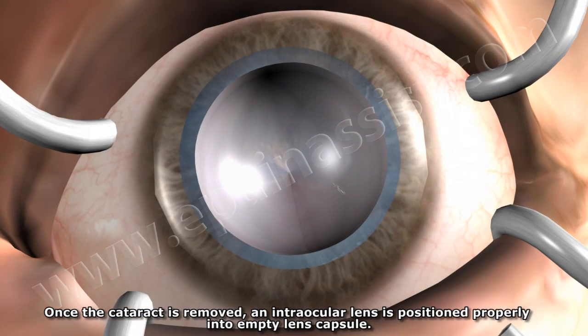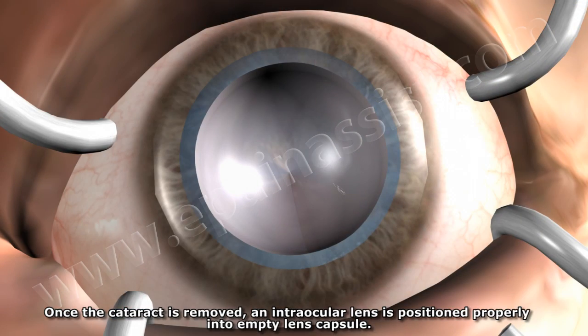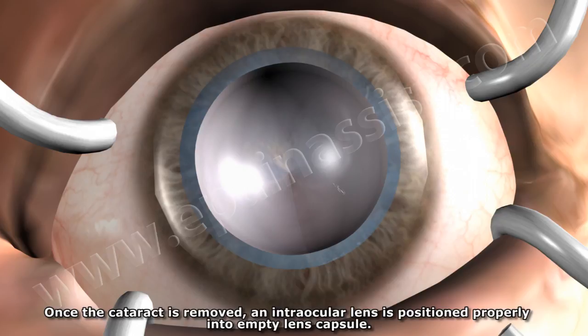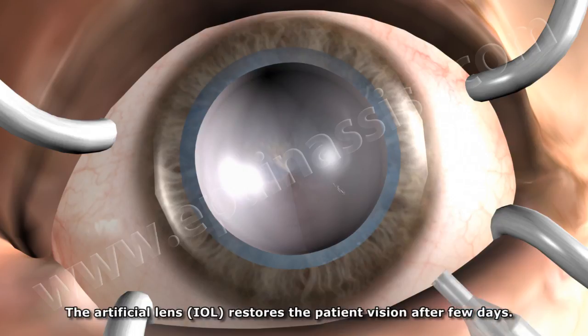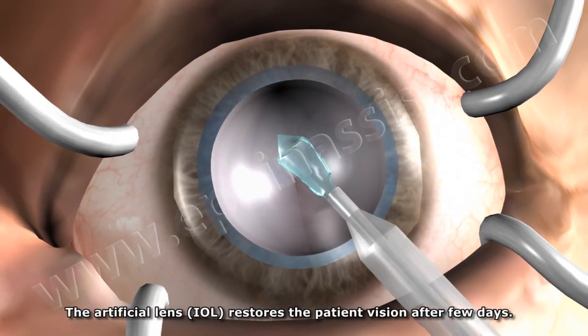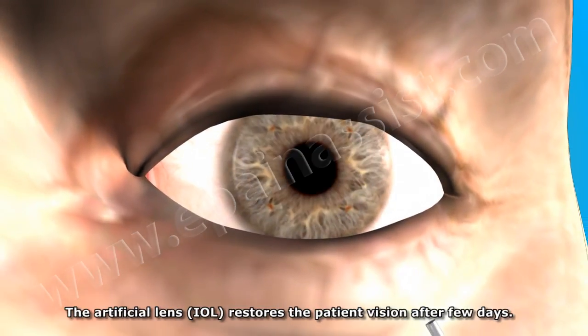Once the cataract is removed, an intraocular lens is positioned properly into the empty lens capsule. The artificial lens restores the patient's vision after a few days.